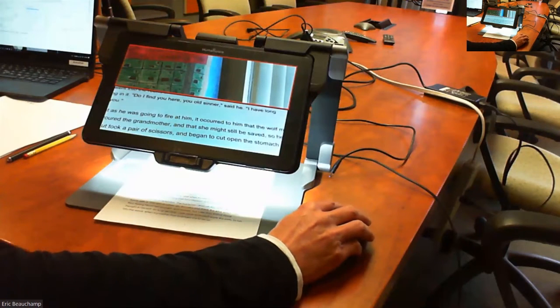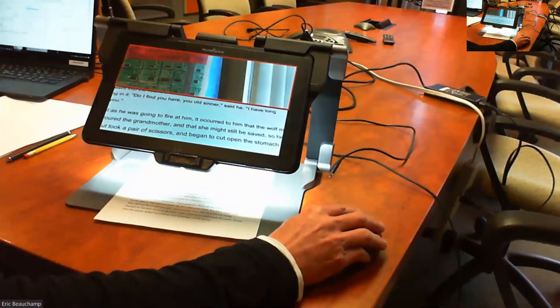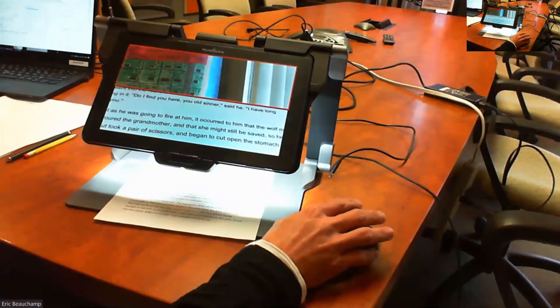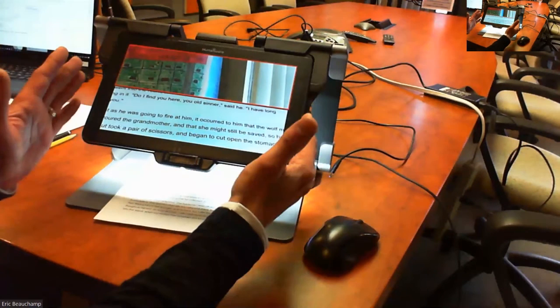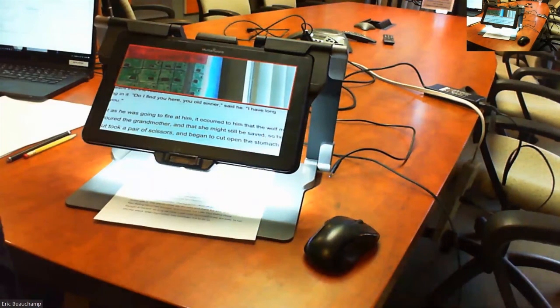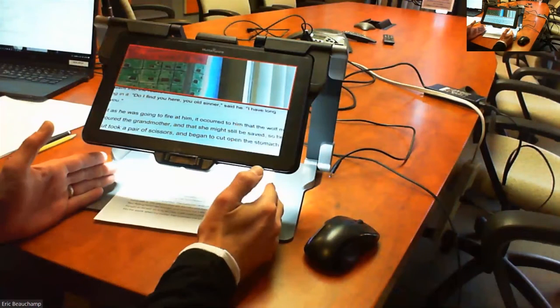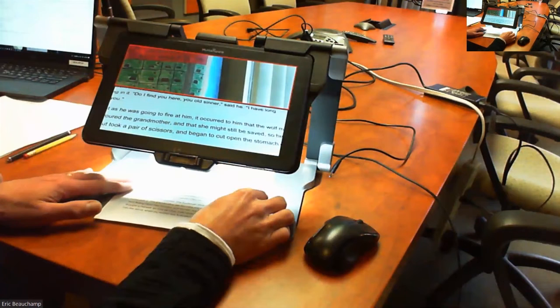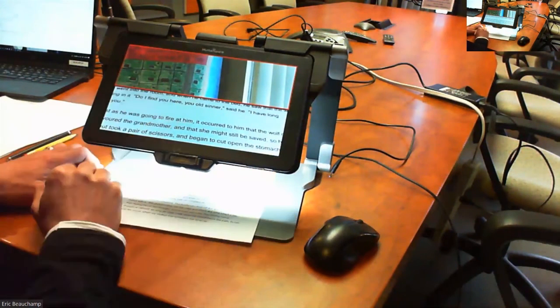Okay, so another question here: Can the screen split for the left and right side instead of bottom and top? No, it's pre-programmed for bottom and top, and the reason why is that you have more screen landscape than you have on portrait. That's the main reason. So you can cover more of your page, more of that width of the page being landscape like this. So you have more screen real estate when you're in landscape. That's why we chose to do it horizontally instead of vertically.